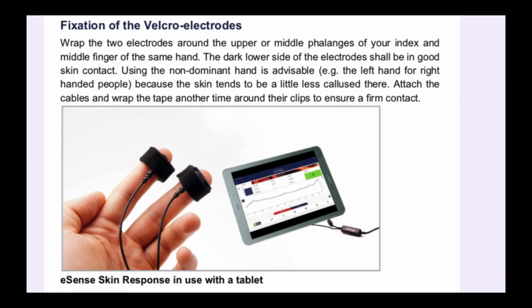Here's a bit about session duration. In comparison with the other biofeedback techniques, you'll need fewer sessions for reliable success. 6 to 10 sessions should be good. To keep focused throughout the entire session, you should limit each session's length to about 30 minutes or less. If you start feeling tired while training, you should shorten your sessions and practice more often instead.